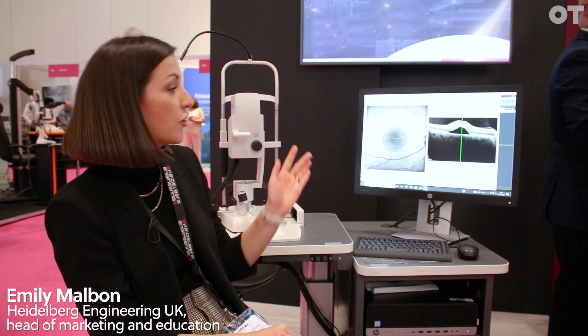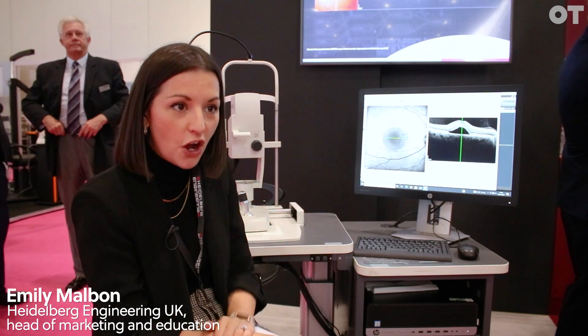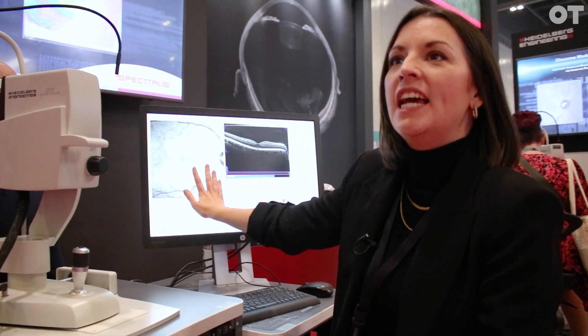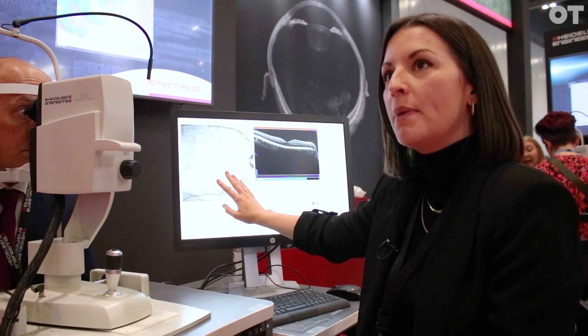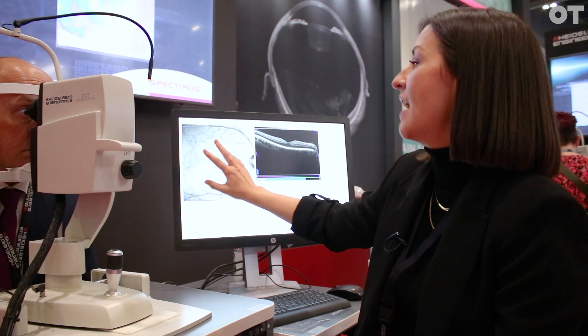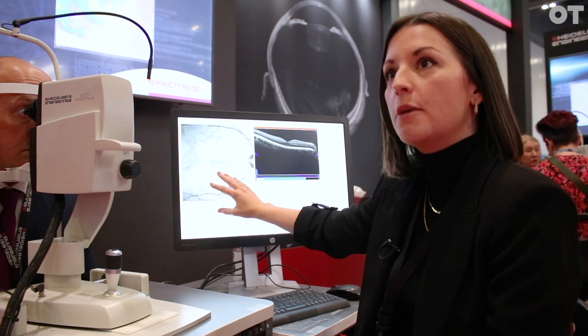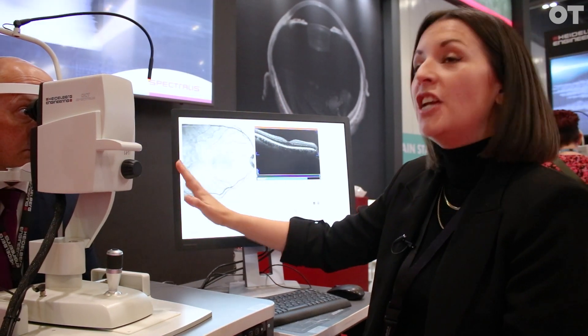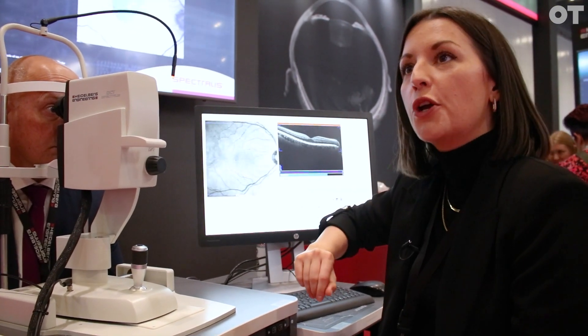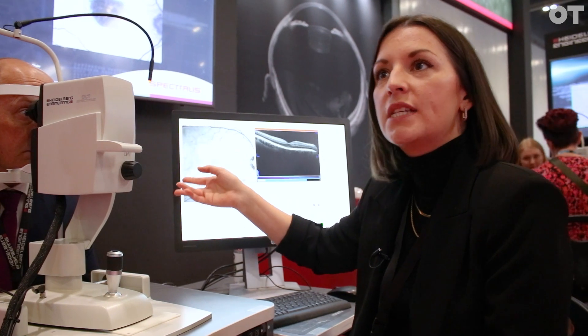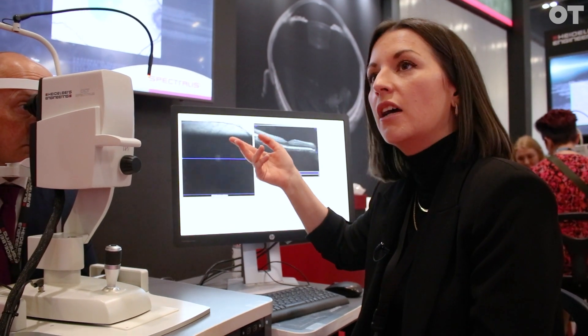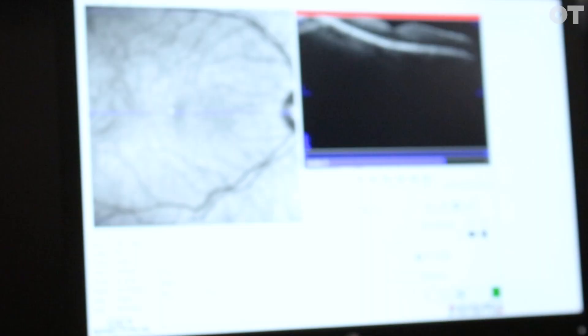We're mainly focusing on our Spectralis OCT platform — our platform for posterior segment imaging, the back of the eye and the retina. You can see here this absolutely lovely live confocal scanning laser image — our infrared image at 815 nanometers. Our patient isn't dilated, we're in this bright room, and the light is completely invisible, so my colleague doesn't perceive any bright flashes or anything.